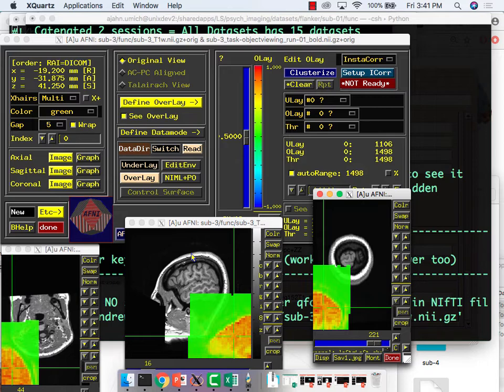Is the align centers in the GUI? I don't think so. You'd have to manually alter the script that gets generated. It doesn't have every single option, unfortunately. That seems like a common one. Yeah, I would like it because I do use it quite a bit.